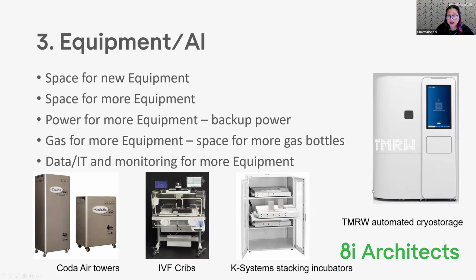So, you know, at the moment, automated cryo storage, such as Tomorrow, is a system that's starting to grow in use. I don't know if it's actually going to solve the amount of storage, because it can't actually store as much as some of the existing cryo storage facilities that we have at the moment.